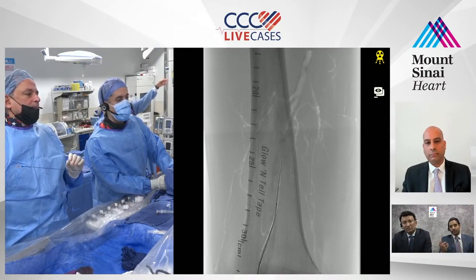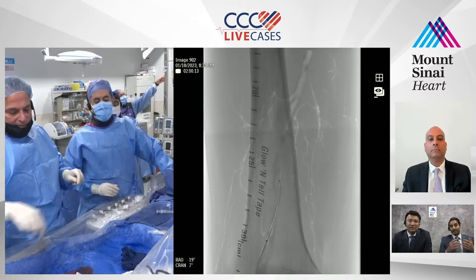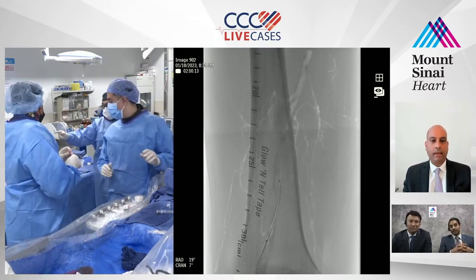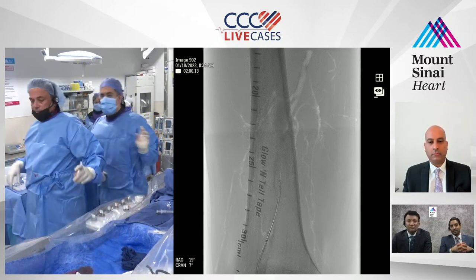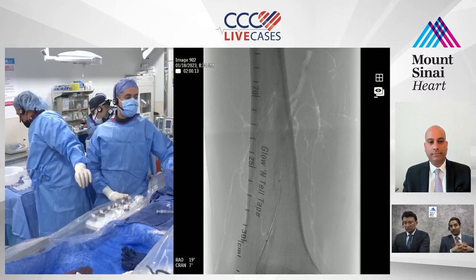I think at this particular point, the fact that she does not have chronic kidney disease is surprising. But that's the typical extra complication. We just try to achieve the best we can without causing too much harm. I think Shockwave again is going to be the only real debulking strategy.